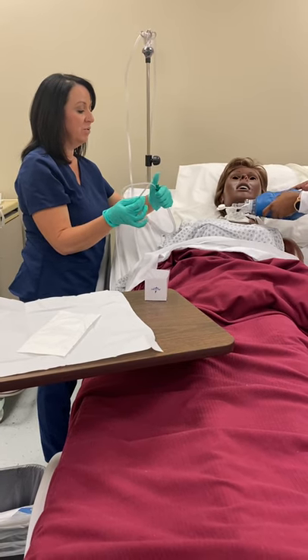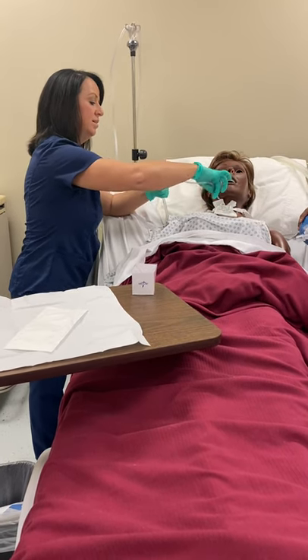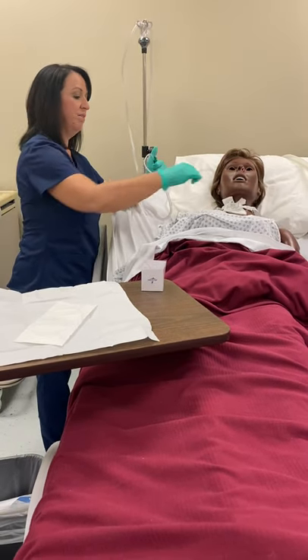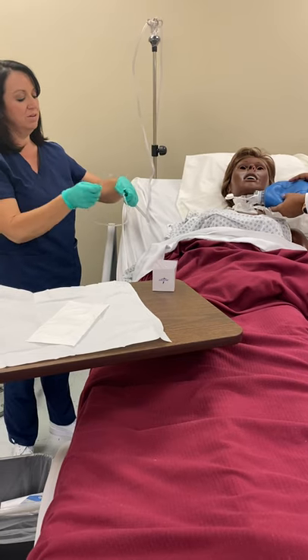She's going to give them two breaths. I'm ready for my second pass — straight down, sucking on the way out. If I needed some saline, I would have it. And now I'm ready for my third pass: straight down, intermittent suction on the way out, and you're done.